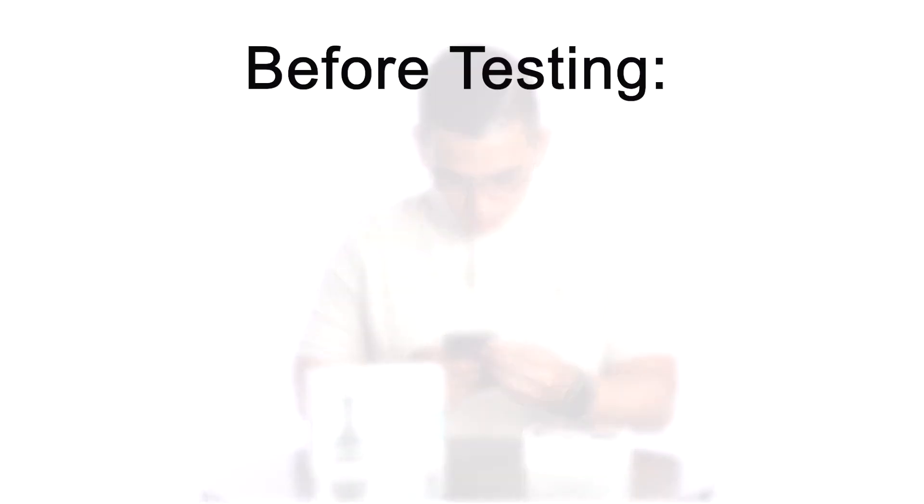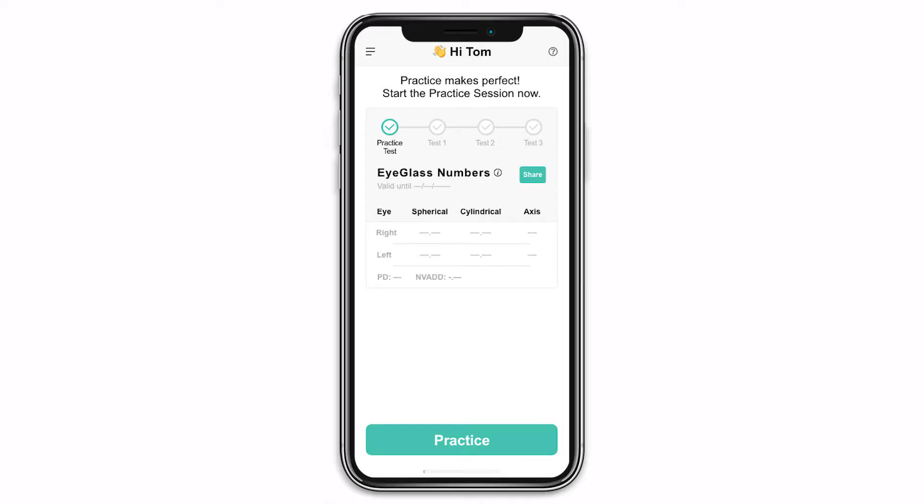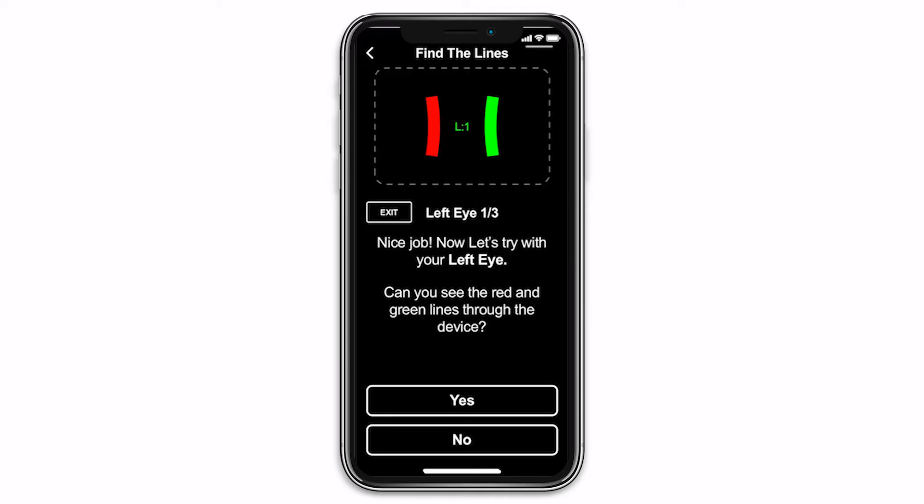Before testing, adjust brightness, turn off zoom mode, and turn up your volume. If you're a first-time user, you'll be prompted to complete a practice session. The practice session will help you learn the three steps needed to successfully complete a full vision test.